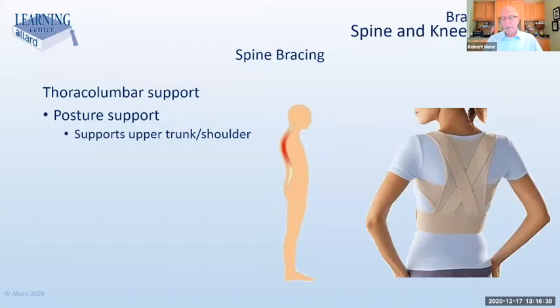But if we put a brace on someone and, because of the support that brace offers, and a little bit of pain relief, they feel a little bit more freedom to move and feel a bit more stable on their feet, and they start pushing a grocery cart through Kroger's, and walking the dog, or being more active while wearing the brace, they're going to get stronger because their activity level is higher. So don't fall into the trap of thinking that because I'm going to wear a brace, I'm going to get weaker. If you can wear a brace and that brace helps you remain more active, then your muscles will become stronger because you're being more active. Anyway, that's just an upper trunk support.